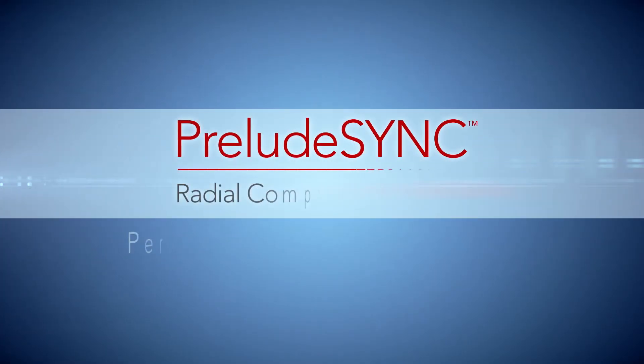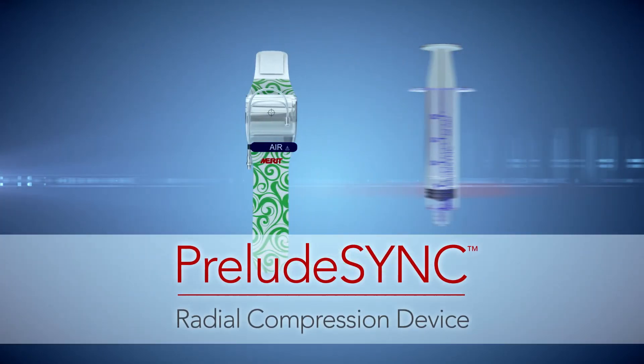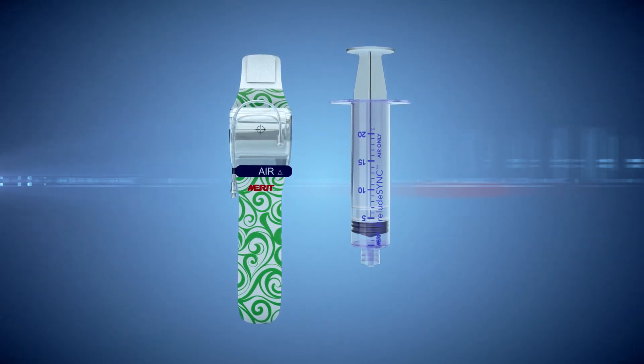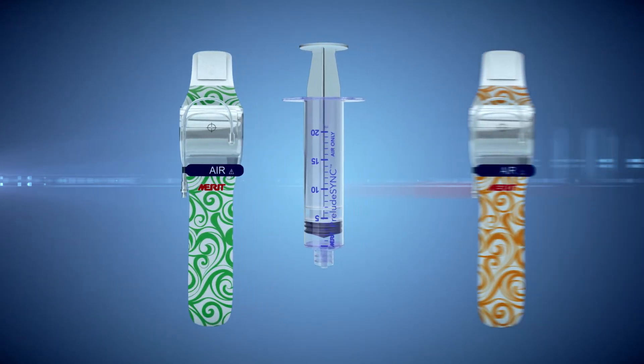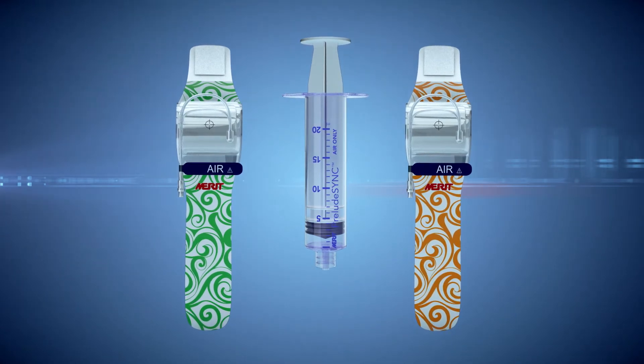Introducing the Prelude Sync, a personal, effective, and comfortable radial compression device that assists in achieving vascular hemostasis. It has a comfortable band with a large clear window for site visibility. The Prelude Sync personalizes the patient's recovery experience with an exciting random assortment of designs provided in each box.